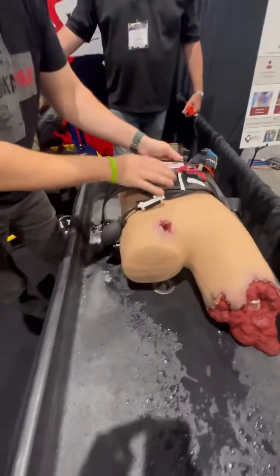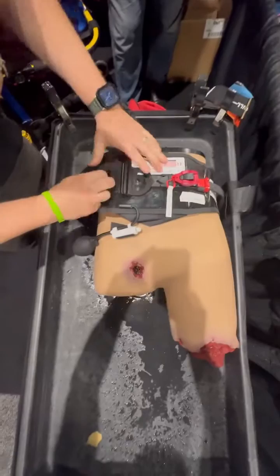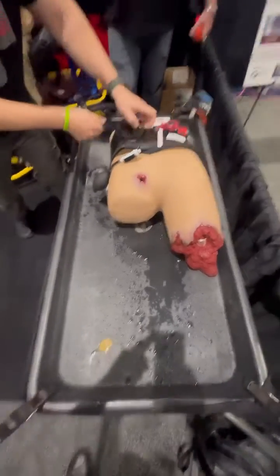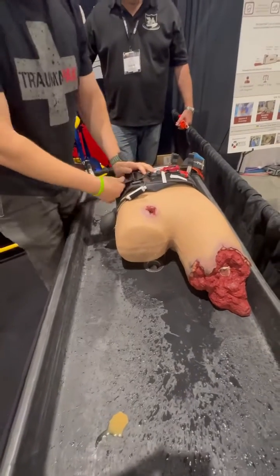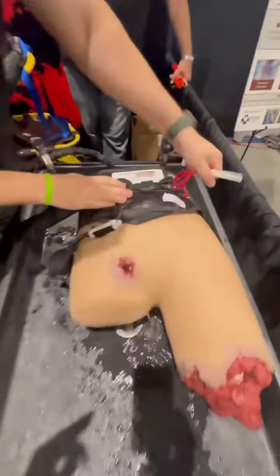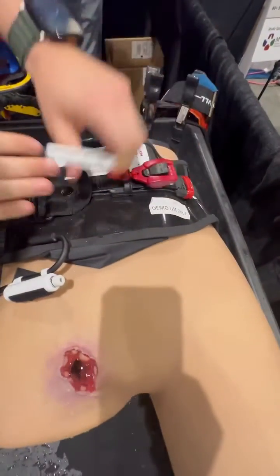I'm going to orient right over the umbilical area and then pull this towards me — that's why I oriented it towards me. I pull this kind of like a traditional tourniquet, high and tight, but here I'm just pulling tight, and now I'm going to use this mechanism to get it nice and snug. Don't need to go super tight.